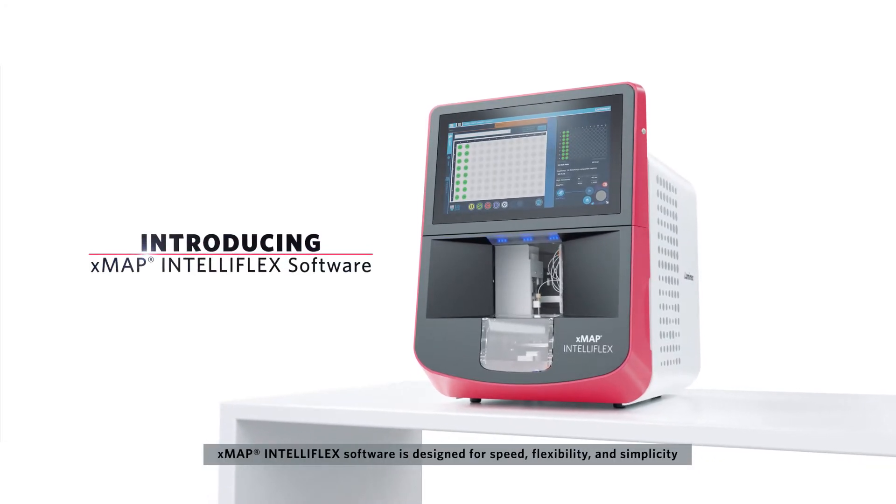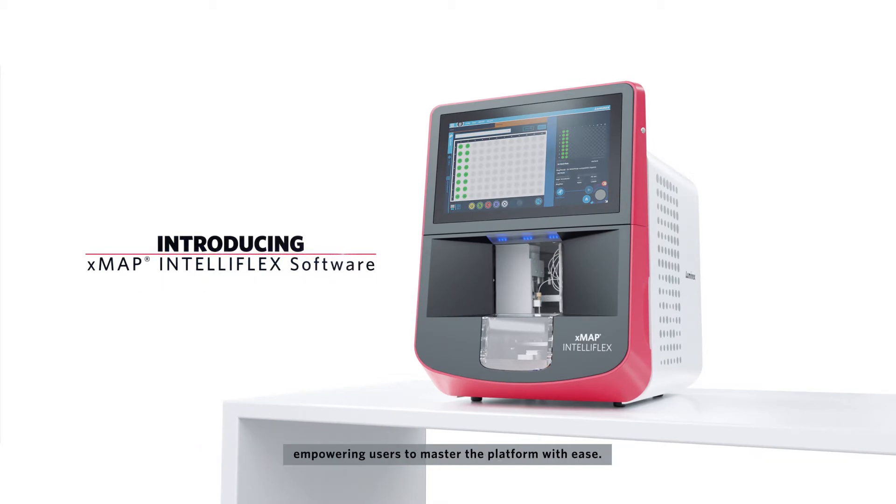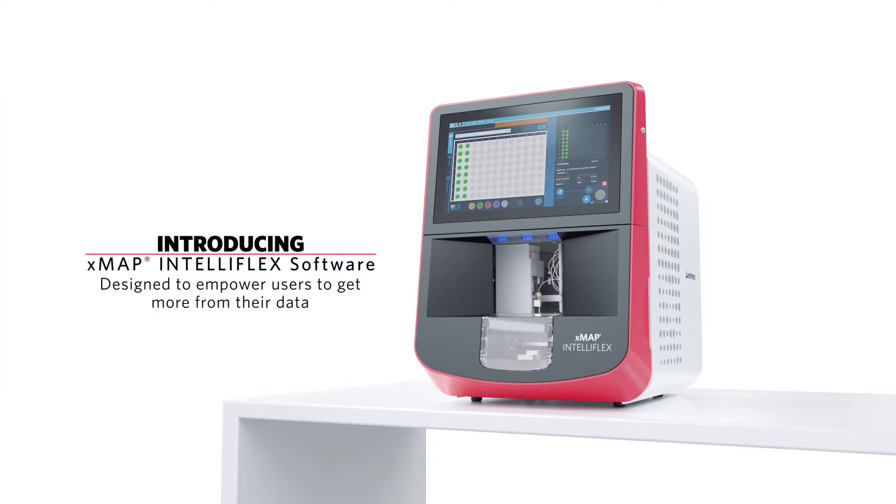xMAP INTELLIFLEX software is designed for speed, flexibility, and simplicity, empowering users to master the platform with ease.